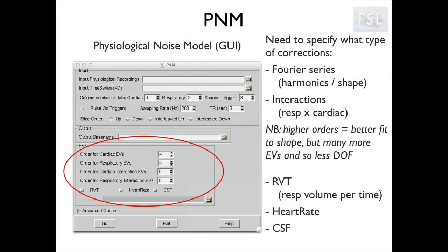Then PNM is going to create some Fourier series - some sinusoidal waves that are centered around these peaks - and they are used to model our physiological traces. We can set the order of the harmonics, so the complexity of the waves, and the higher the order, the better the fit to the trace will be, but also the higher the number of additional EVs will be produced and we will have less degrees of freedom.